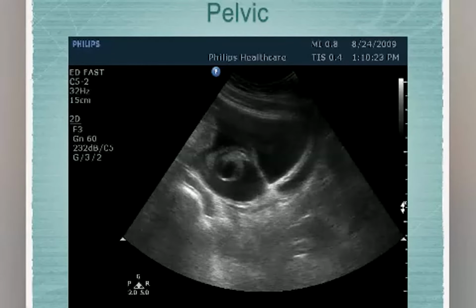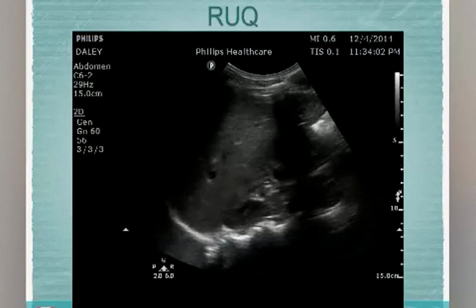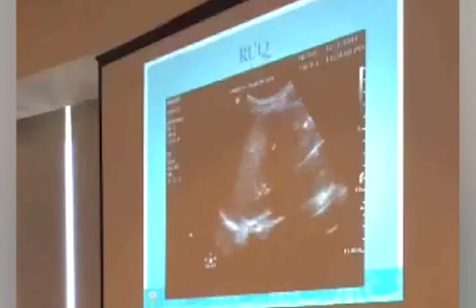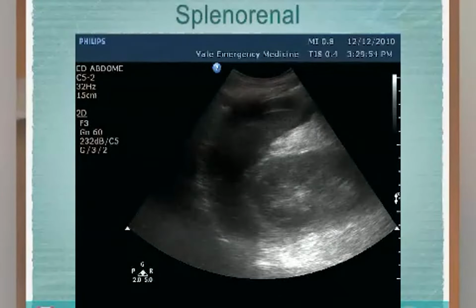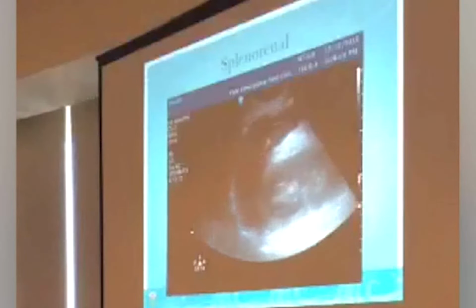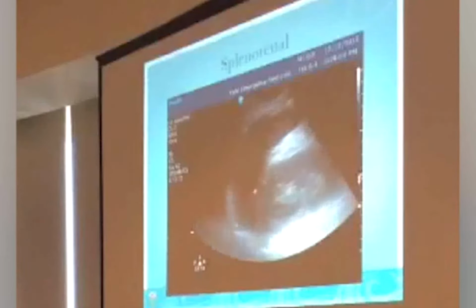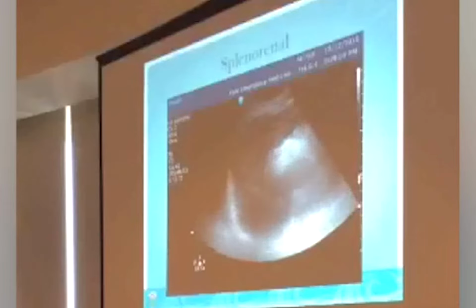This is a positive, lots of fluid all around the uterus there. Positive or negative? Yeah, so there's a little line of fluid that's tracking all the way through there. Something that looks kidney-ish over here, something that looks maybe spleenish over here. In the space between the two, if I just look right there, there's some shadow in the way. I wouldn't call that positive. But above the spleen, between the spleen and the diaphragm, and all the way around the tip, lots of fluid.